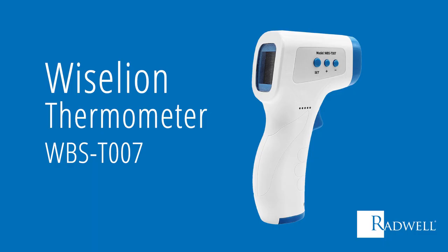In this video, we will provide an operational overview of the Wiselion WBS-T007 thermometer.